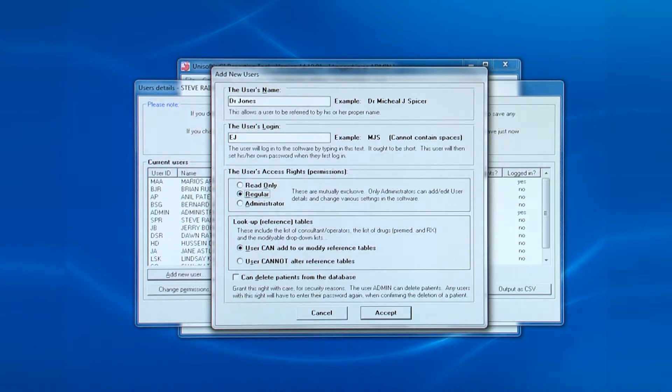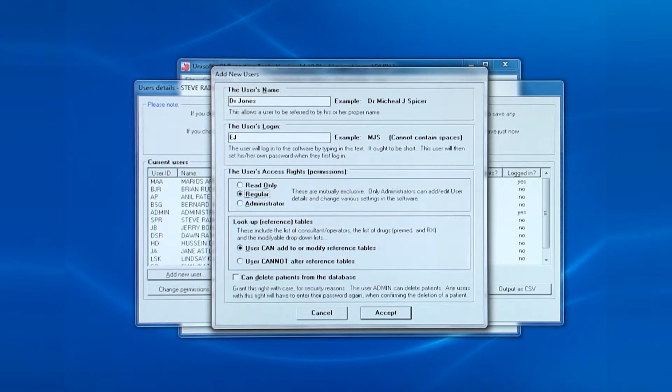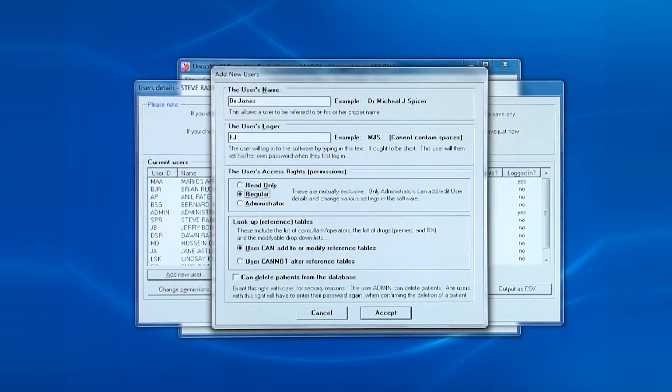Next is their access rights. Read only, regular or administrator. The default is regular.